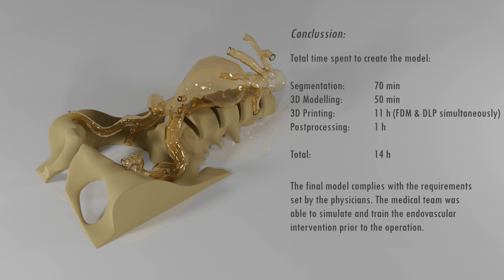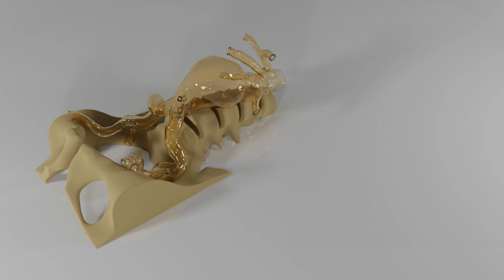Finally, they found a solution for the unique pathology of the right common iliac artery. This reduced the risk of rupture of the vessel during the procedure and shortened the time in the operating room by 25%. This brings me to the end of today's case study.